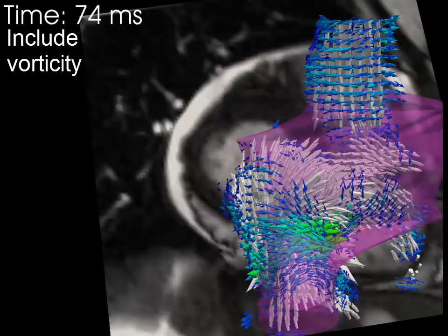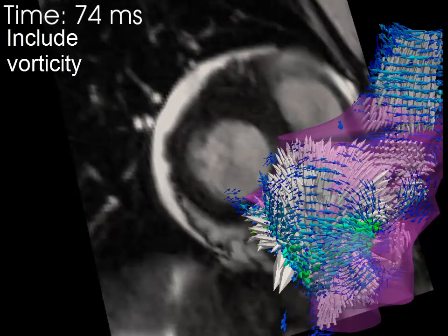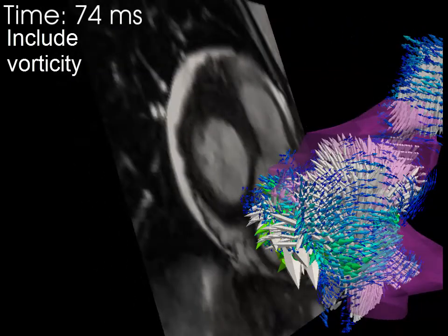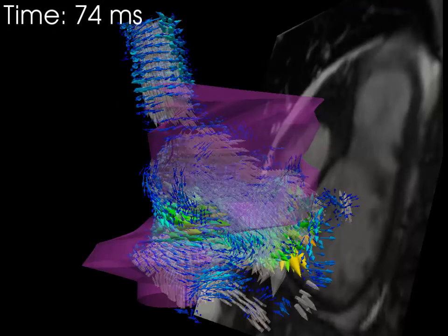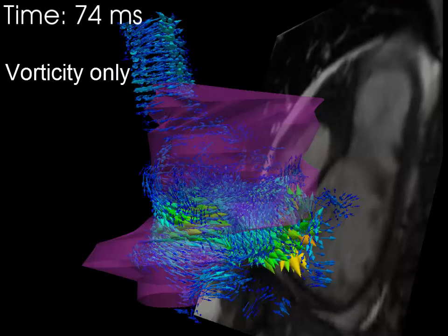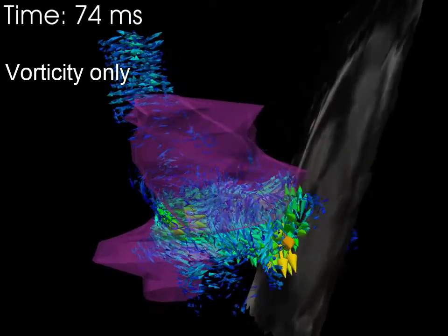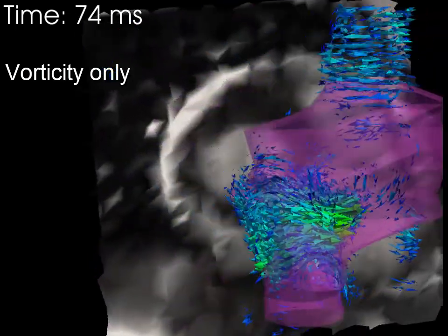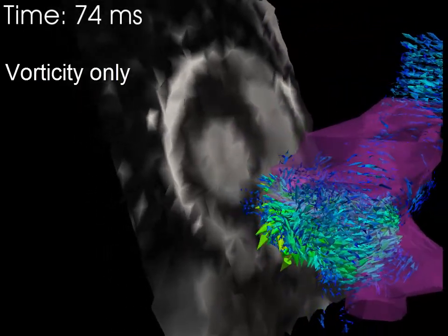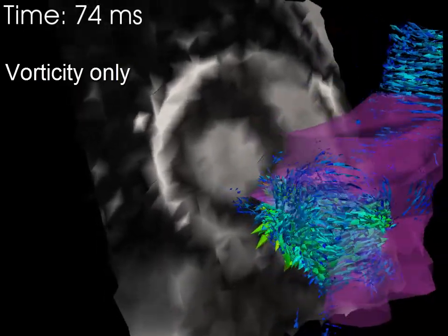The regurgitant jet also contributes significant vorticity during systole as is shown by the colored vectors. The only other significant vorticity at this point in early systole is generated on the walls at the top of the inferior vena cava.